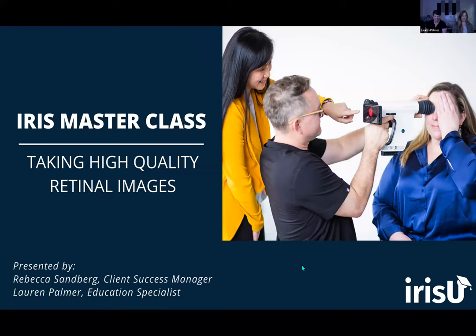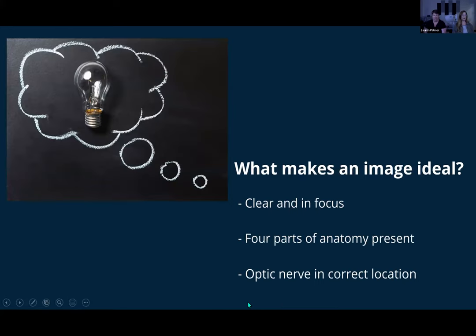So as Rebecca mentioned, today we're discussing how to capture high quality retinal images. So we're going to start off by talking about what a quality retinal image looks like. Then we will go into discussing troubleshooting different types of images and understanding what's happening in those. As Rebecca mentioned, if at any time you have a question, please feel free to put it in the Q&A.